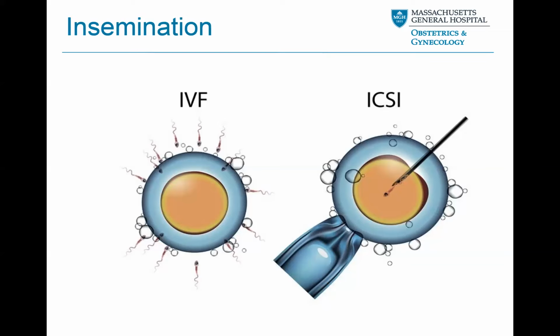So I just had a really great question. Are all my eggs and all the sperm put in one dish for insemination? The answer is no. So we don't put everything into one single dish. We divide them into different dishes. So we never inseminate more than 4 eggs in one dish. And in that way, we don't want to put too high of a concentration of sperm. We try to balance it out. So we are very specific in the numbers of sperm that we are inseminating eggs in. Our concentration for conventional insemination is 50,000 motile sperm per dish. And so we're very conservative. That sounds like a huge number, I'm sure, but that's actually a very conservative number of how many eggs and sperm that we put together. So, great question.